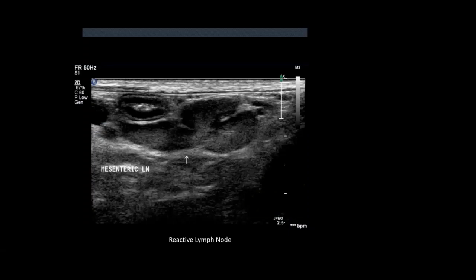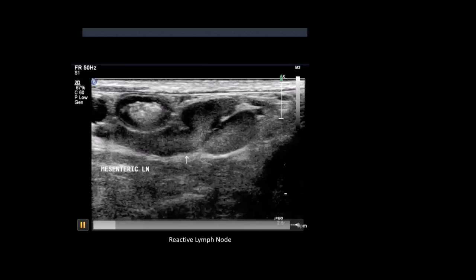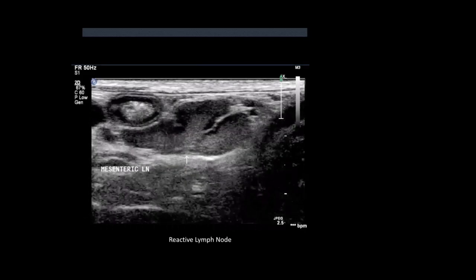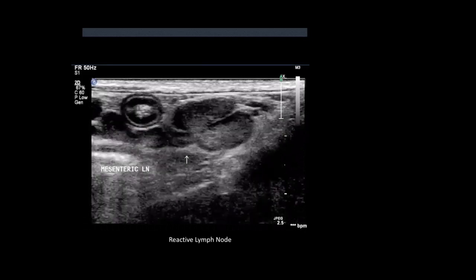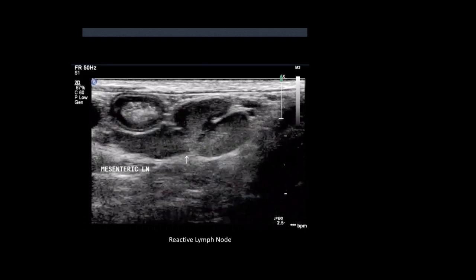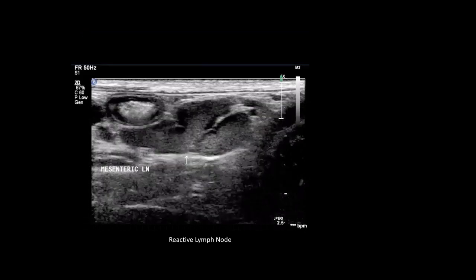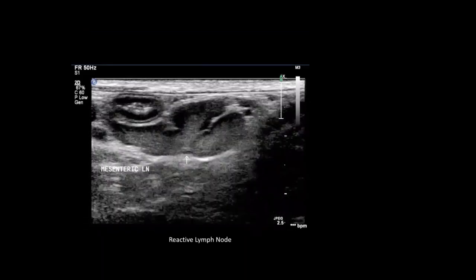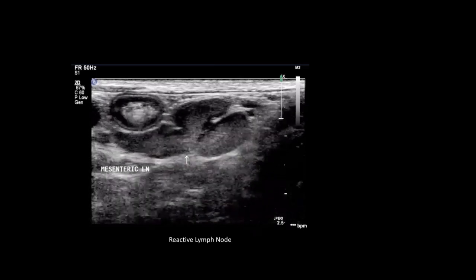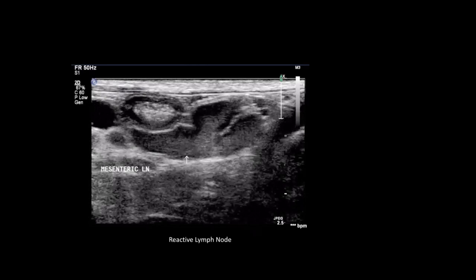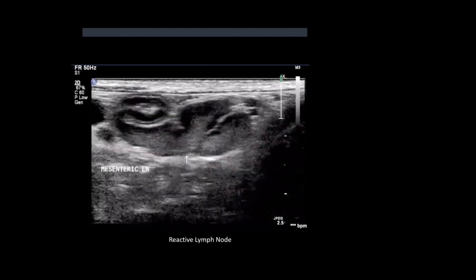Here's a reactive lymph node - this is from a puppy that was about eight weeks old and just had an upset tummy. This was an incidental finding of some reactive mesenteric lymph nodes, which you can see here. They're a little bit plumper and slightly hypoechoic there, actually. So that's an example of a reactive lymph node.